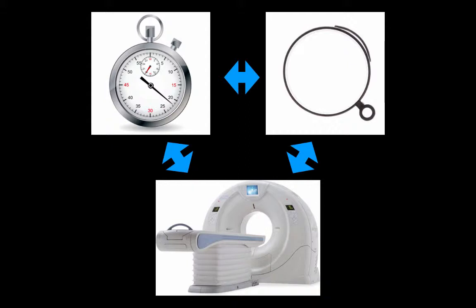All right. I am not asking or telling you to hold up transporting your patient to the CAT scanner or to the OR because you want to get a few more clips. But sometimes it takes an extra 30 seconds, particularly if you get good at this, to kind of hover over that AAA, watch it move, and maybe get another view or two that can really help you out.